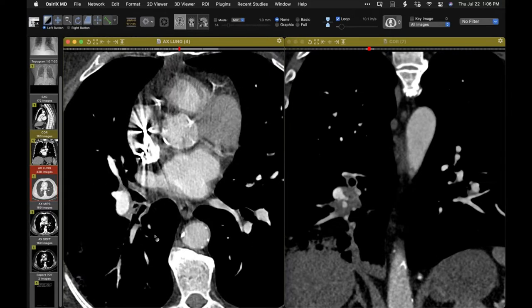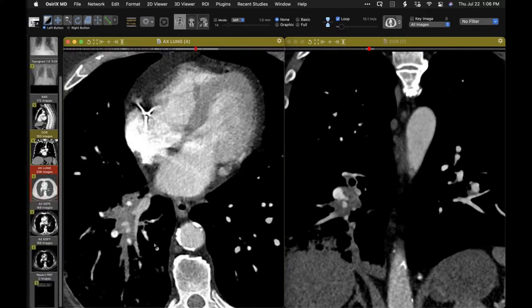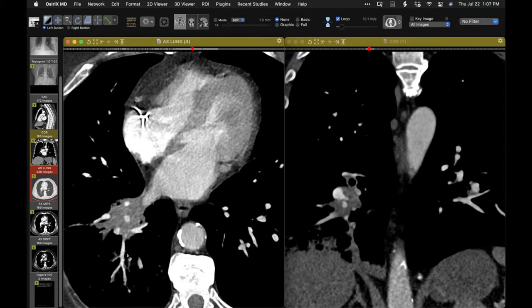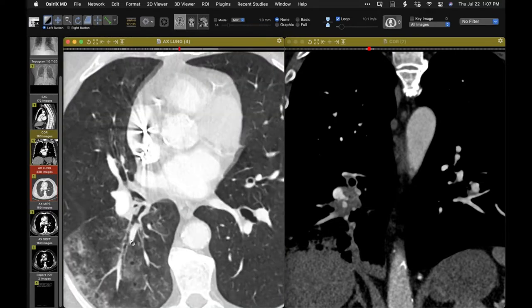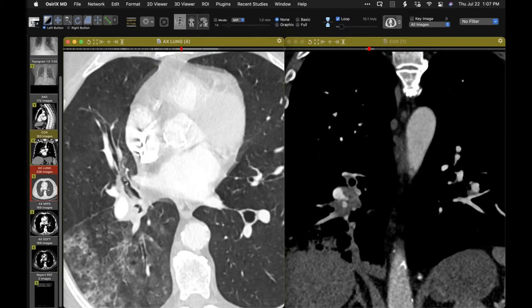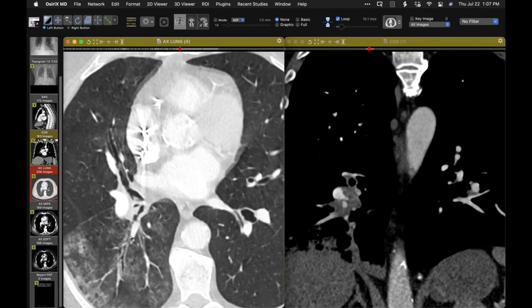There's intraluminal material. It's a little difficult to determine what's going on. I would speculate that there is pre-existent accumulation of material in the lumens of these airways, proximal to the abnormal airway here. And there's also some abnormality within the lumen of middle lobe bronchi proximally. So this is a bad situation, and unfortunately, he did not survive this.